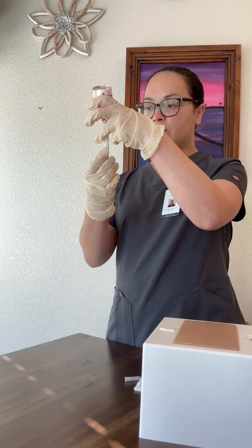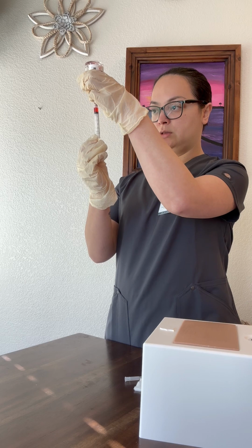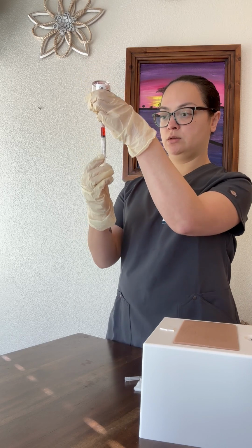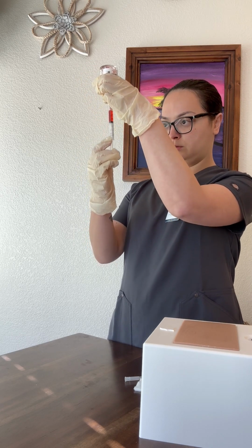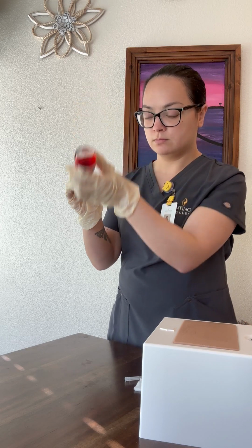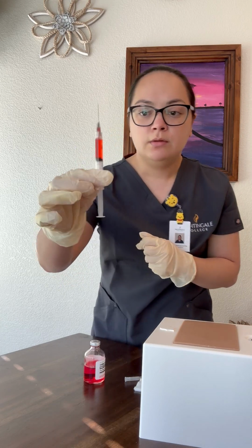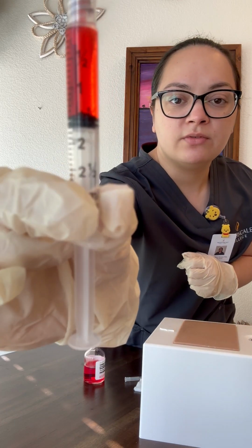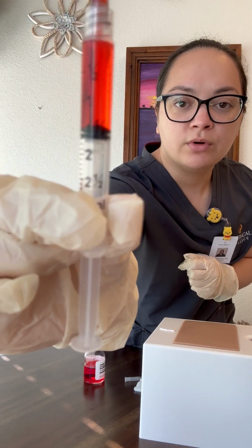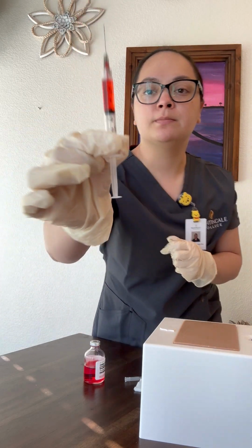Inject, invert, and now we will grab 1.5 milliliters of morphine. No bubbles. Just to verify, 1.5 milliliters of morphine.